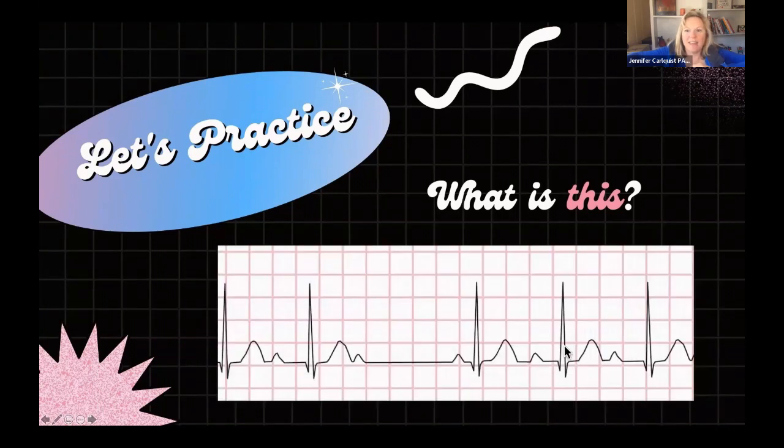Okay, and then this was just another example for you to see another type of heart block. We already covered this one, but what would you say this one is? You've got drop, long, longer, longest drop. You'd need a longer strip to see it, but it's going long, longer, longest drop. And that is none other than the winky. Janice says, winky, winky. Yeah, that one's a little bit tougher.